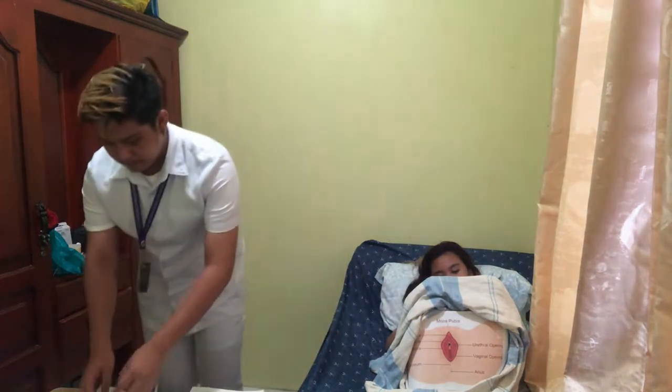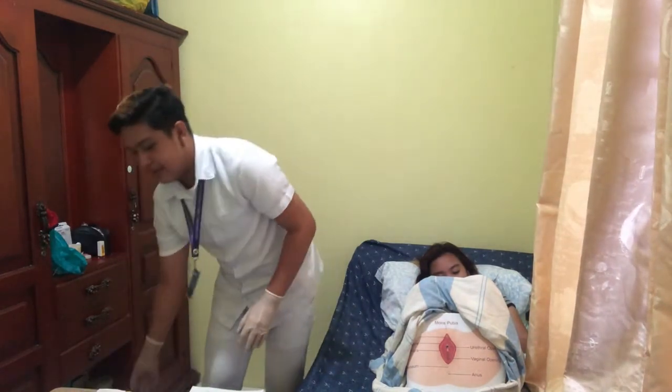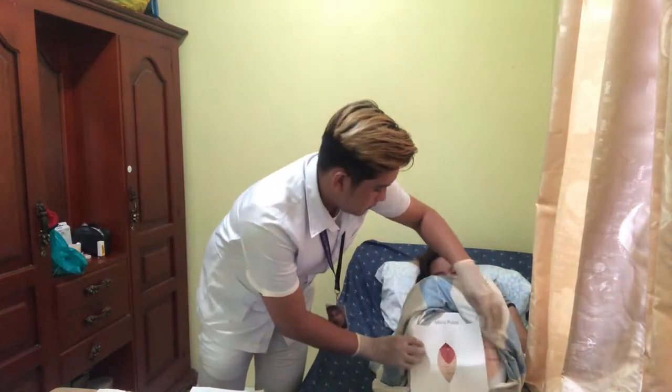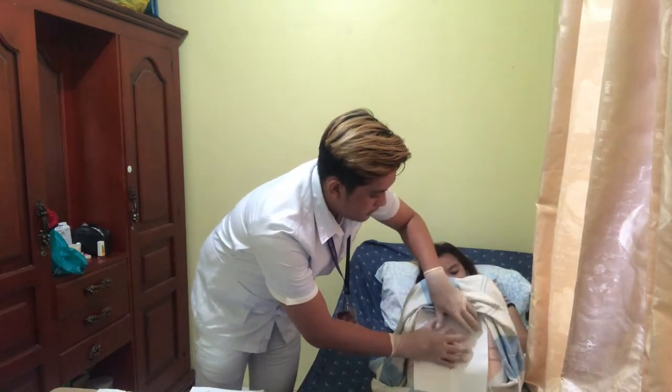So next, we'll open the set while observing the sterile technique, and after that we'll now put on our sterile gloves. This is also for hygiene purposes and to avoid the spread of unwanted microorganisms. Okay, so after wearing our gloves, we'll now put on the eye sheet. So I will discard this pad. Going to put the eye sheet on the bed.